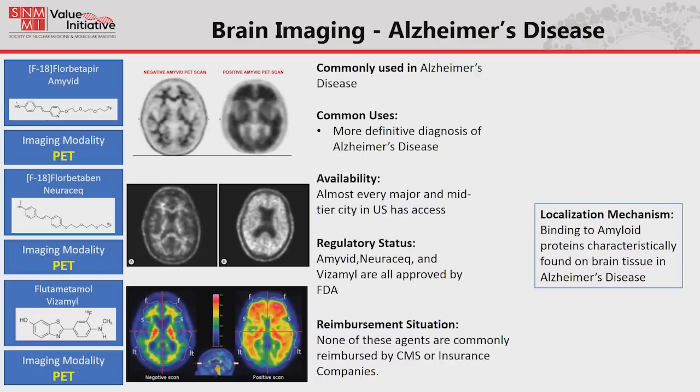I should go back and say the ones on the left is what normal uptake is. That's white matter uptake. But when you start developing amyloid plaques on the cortex, which is the outside of the brain, that's what you see on the right-hand side. They look a little bit different, but in all cases you see the amyloid spreading to the outside.